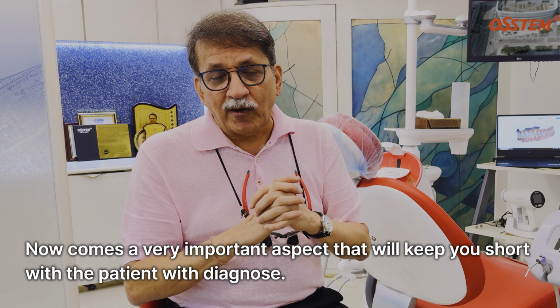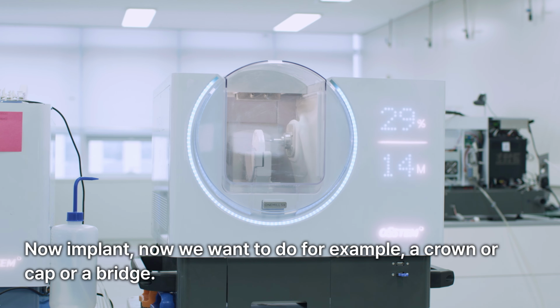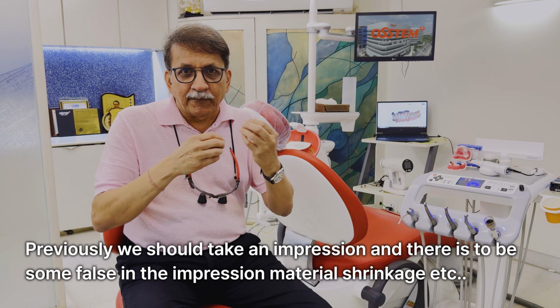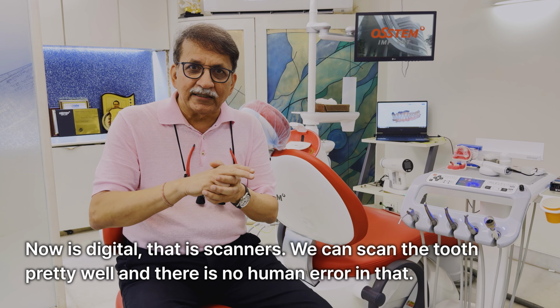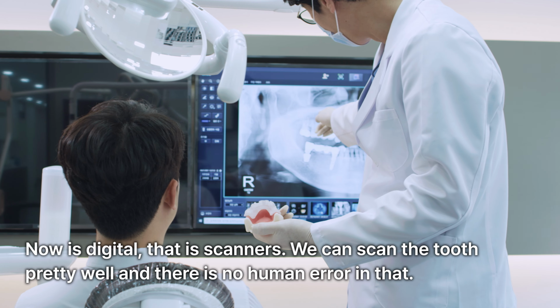Now comes a very important aspect. Okay, we showed the patient, we diagnosed, now we plan, now we want to do, for example, a crown or cap or a bridge. Previously we used to take impressions and there used to be some faults in the impression, material shrinkage, etc. Now it's digital, that is scanners. We can scan the tooth pretty well. There is no human error in that.